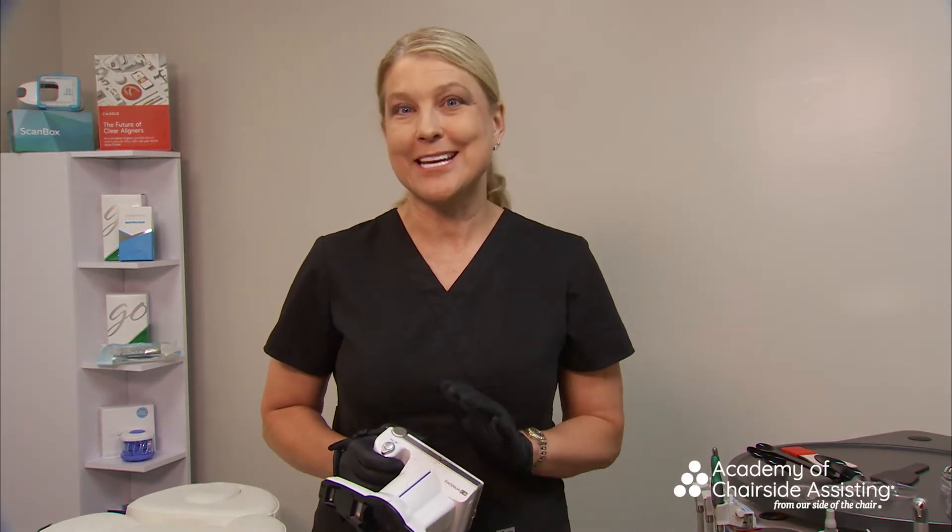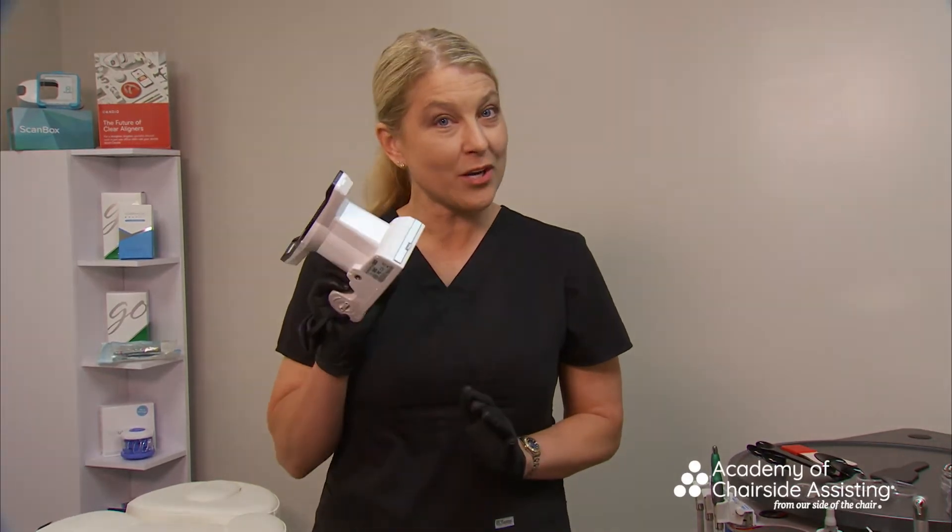We're going to start with the Shofu, and I think for those of you who are really struggling with the SLR or DSLR camera, you're going to see how nice, easy, and efficient this point-and-shoot camera will be.